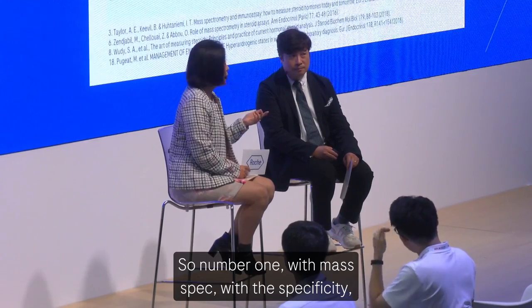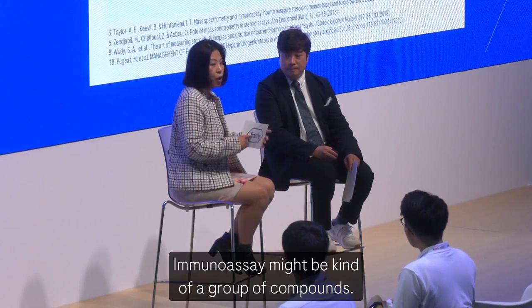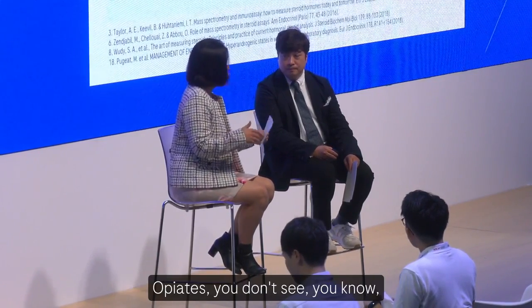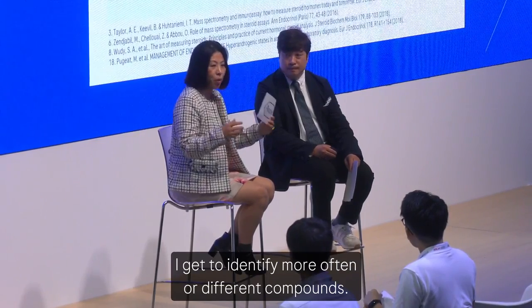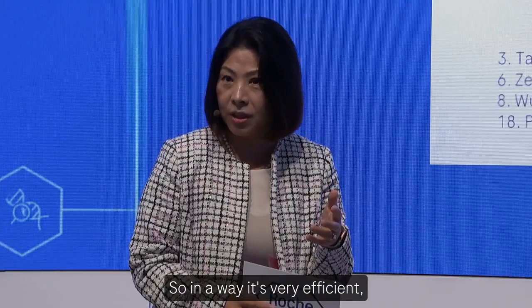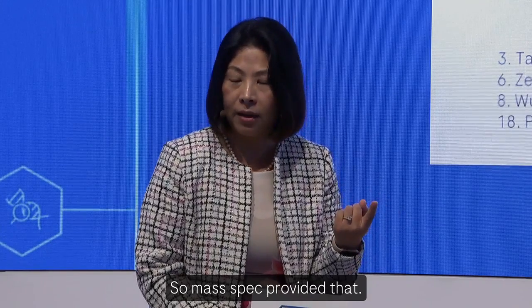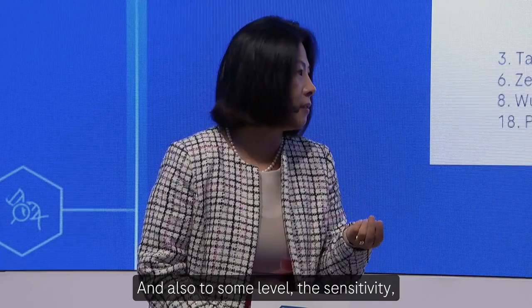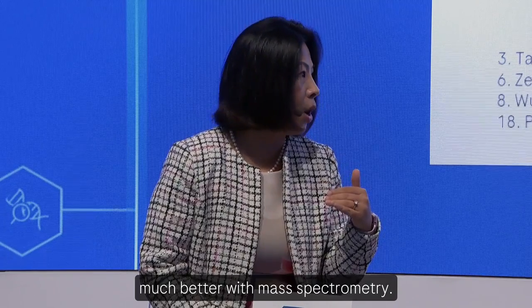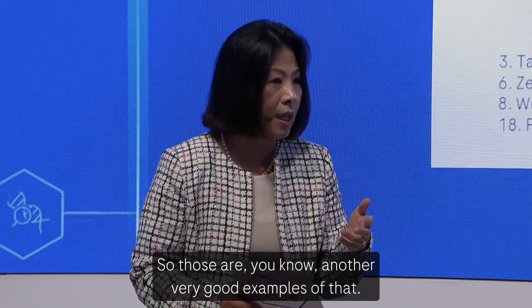So number one, with the mass spec, is the specificity. It's very specific. Immunoassay might detect a group of compounds. Drugs of abuse are a good example, right? We also have the class of a compound, like opiates. You don't identify morphine or different individual compounds. It's the class. So in a way, it's very efficient. But on the other hand, you miss the opportunity to identify individual compounds. So mass spec provides that. And also, to some level, sensitivity, where you can measure very low levels of compounds much better with mass spectrometry. So those are very good examples.